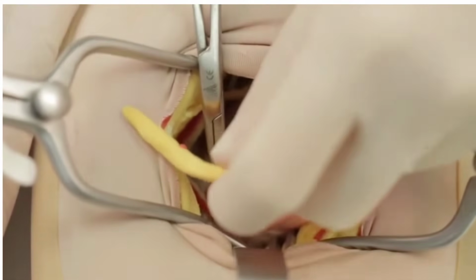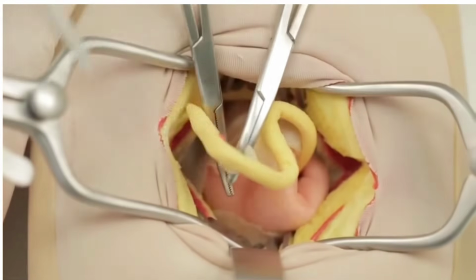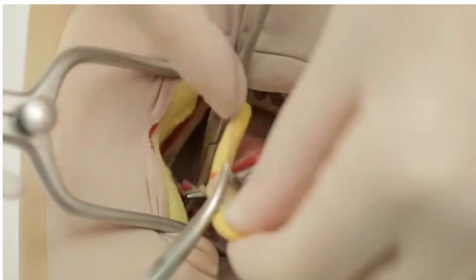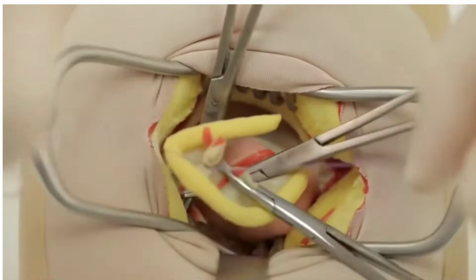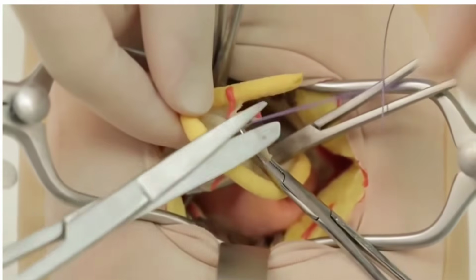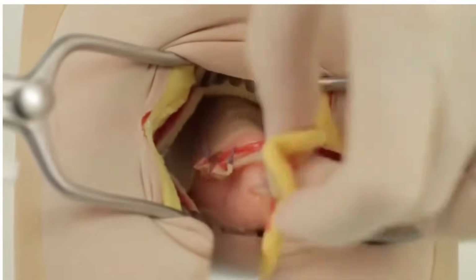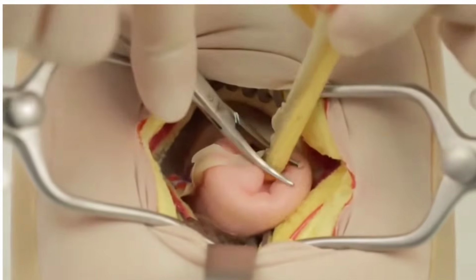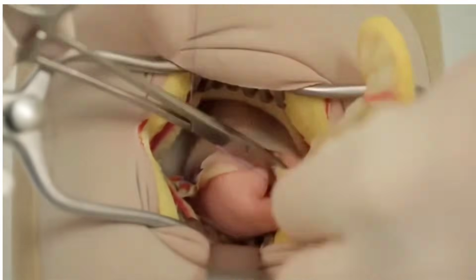At the base, place a crushing clamp about 5 millimeters from the cecum. Remove the clamp and tie a transfixion suture of absorbable material at the crush site. Place a second ligature if needed. Divide the appendix between the ligature and the clamp. Remove the appendix from the field.